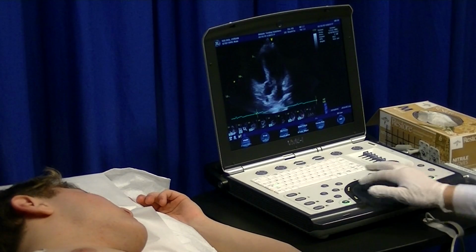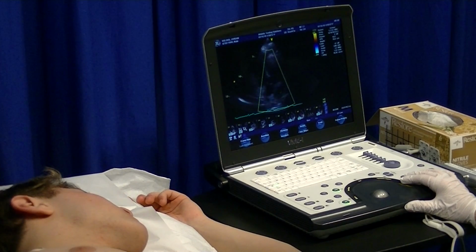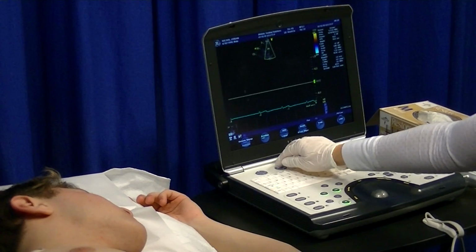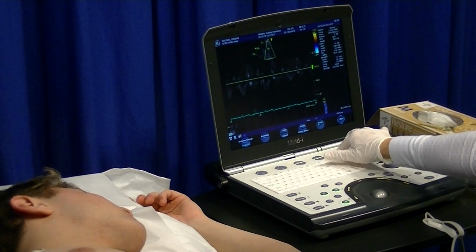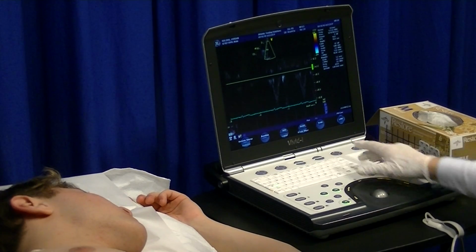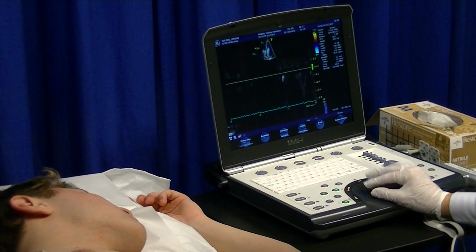Just breathe. Next, I'm going to put color flow over that 5-chamber view. I'm going to obtain a pulse wave signal of the LVOT now. Pause your breath. Adjust scale as needed. Breathe. And blow all your air out. Pause right here.